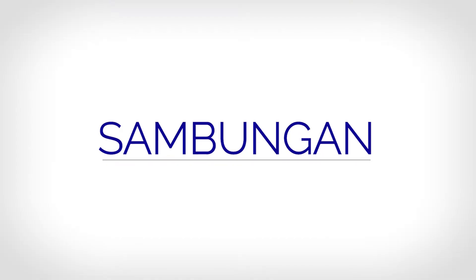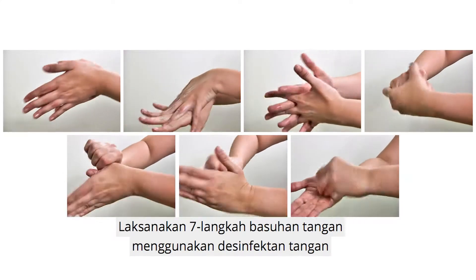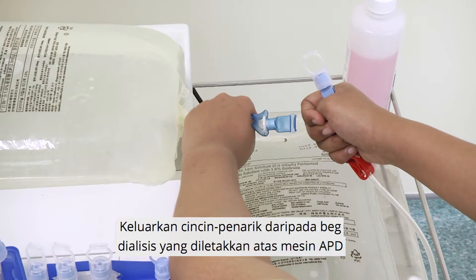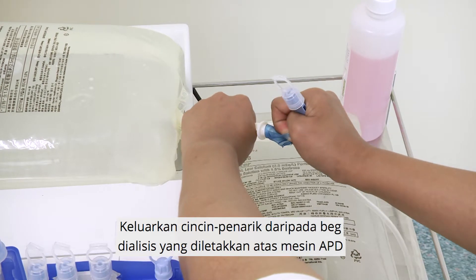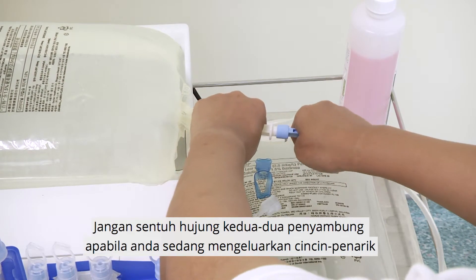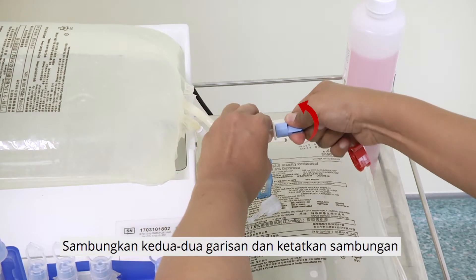Connection. Perform the 7-step hand rub using the hand disinfectant. Remove the heater line from the organizer. Remove the pull ring from the dialysis solution placed on the APD machine. Do the same for the heater line. Do not touch the tip of both connectors when removing the pull ring. Connect both lines and tighten the connection.